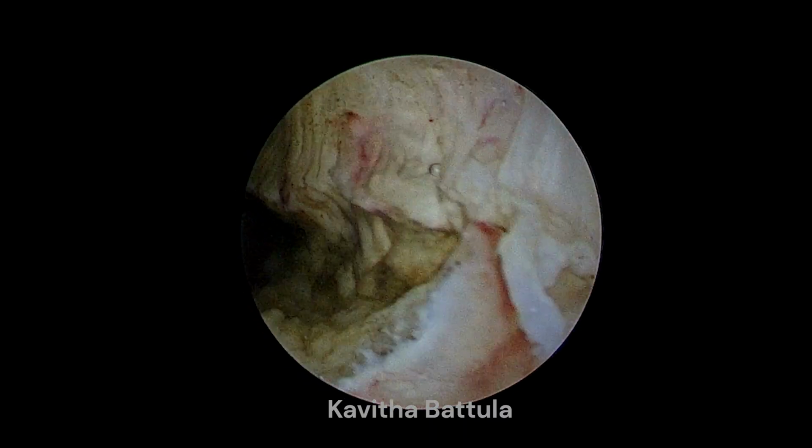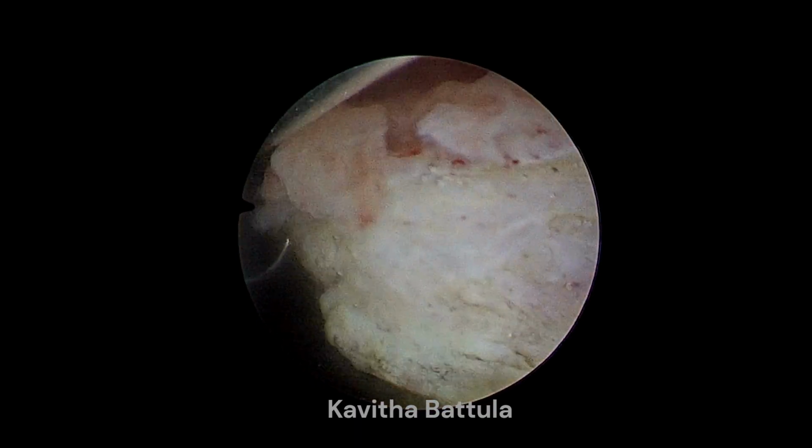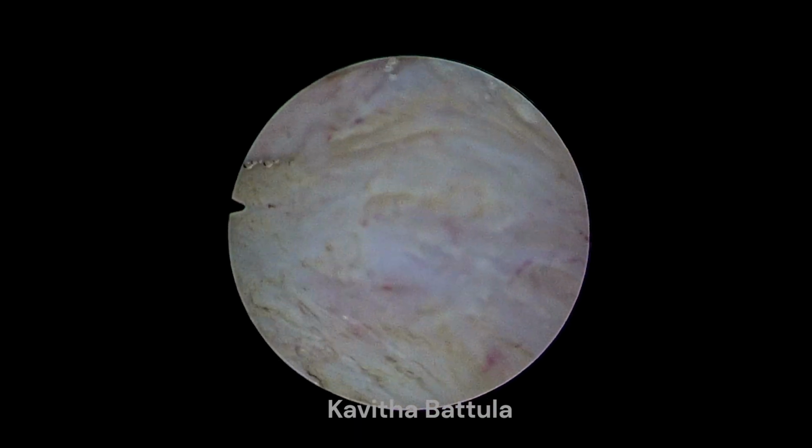Please go on and watch the posterior and anterior, both submucous fibroids being resected.